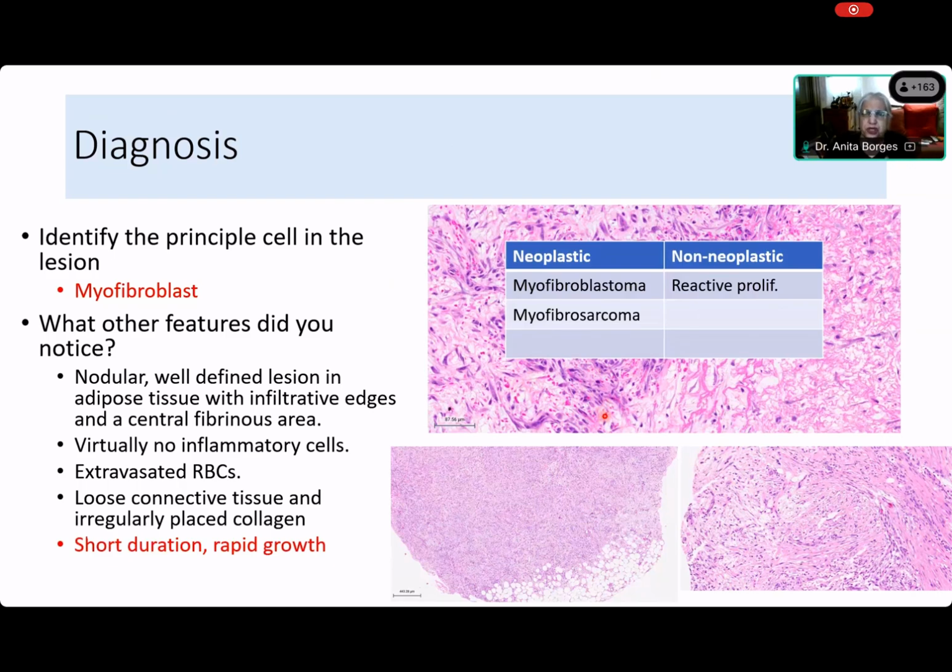It's full of mitoses, it's got infiltration, it's got atypia, it's got all sorts of things. But because it has a short history and rapid growth, and it has reached a size of 2 centimeters literally in the period of a month, there is no malignant tumor that grows like that. And if there was a malignant tumor that grows like that, it would be very obviously malignant. Okay, so this is nodular fasciitis.